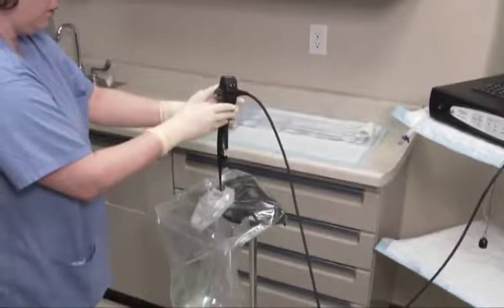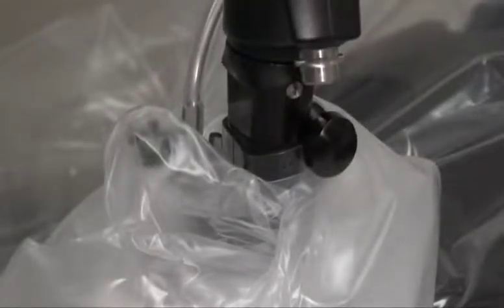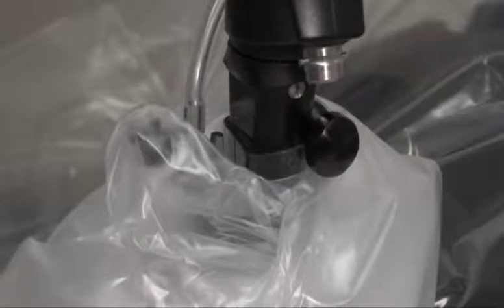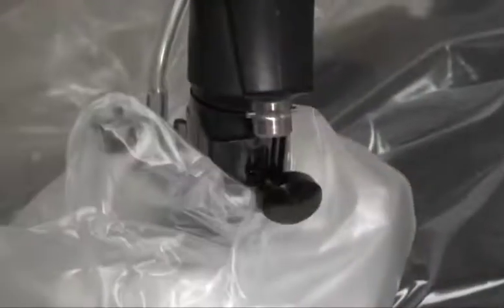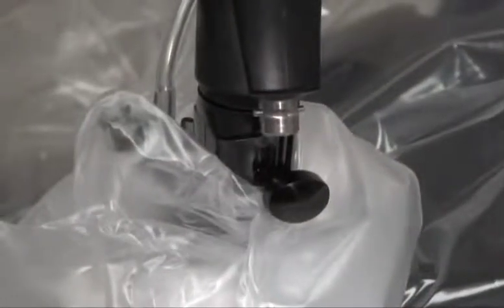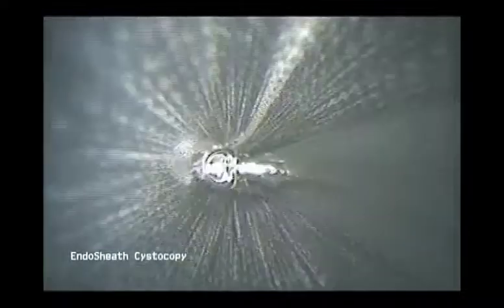Gently slide the insertion tube into the sheath. Do not twist the insertion tube during installation as it may create resistance. Align the locking knob on the cystoscope with the vertical slot on the sheath connector. When the locking knob is fully seated in the slot, rotate it to a horizontal position — this secures the fit between the sheath and the cystoscope. You can verify proper seating of the cystoscope distal head into the sheath window by visualizing a clear image on the screen of the DPU. No glare should be evident and the sheath window should be in direct contact with the insertion tube distal head.